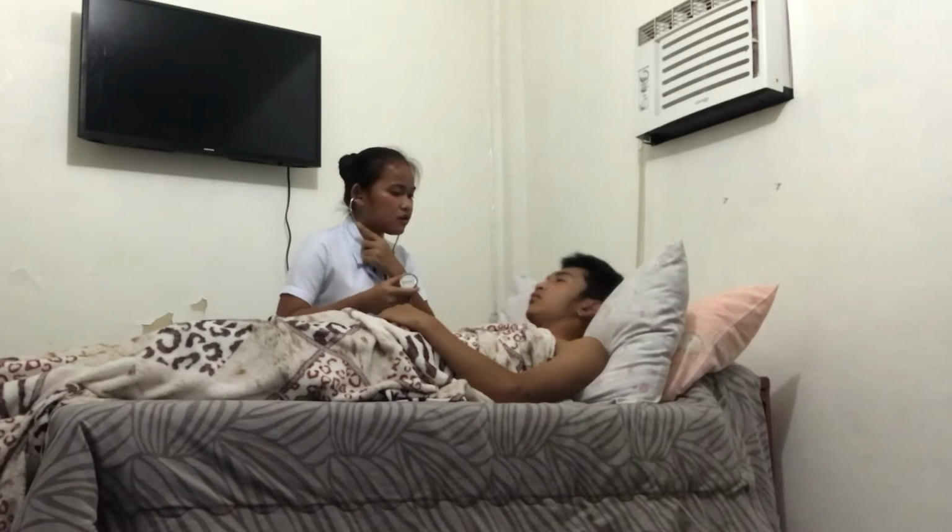So if a bruit was heard, we need to gently palpate the artery to determine the presence of a thrill. A bruit is an audible vascular sound associated with turbulent blood flow, and a thrill is a vibratory sensation felt on the skin overlying an area of turbulence and indicates a loud heart murmur, usually caused by an incompetent heart valve. Also, we need to listen on the other side of the neck. So place it here.